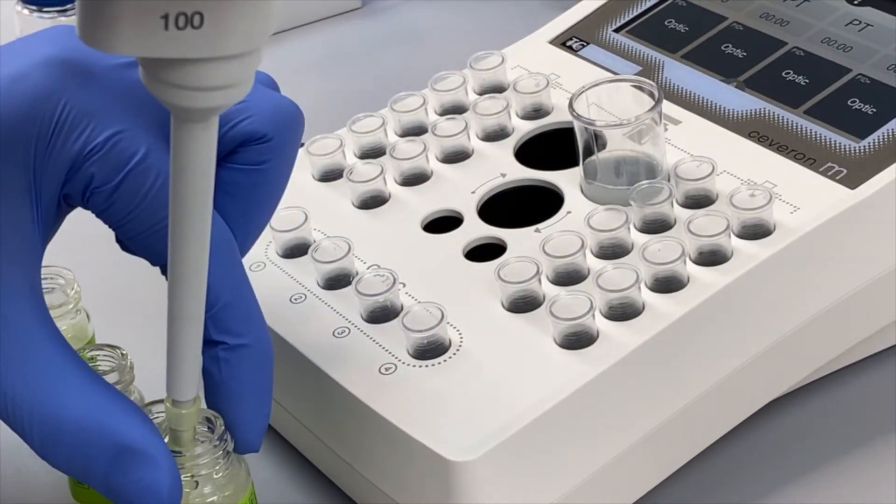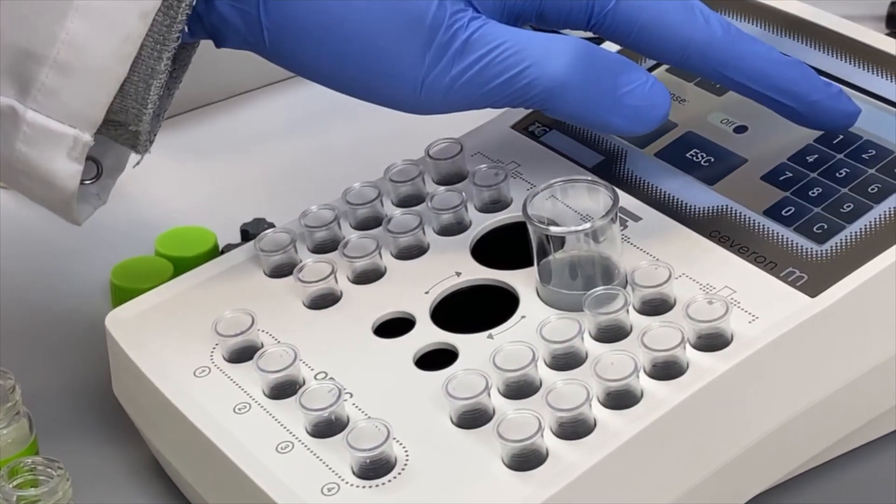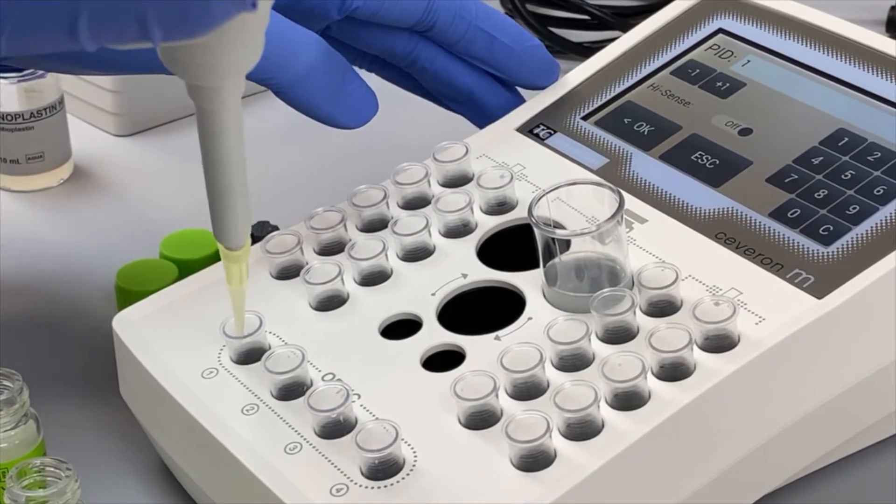Due to the combination of a minimal total cuvette volume of 75 µL and a high optical resolution, even the weakest clot formation will be detected.